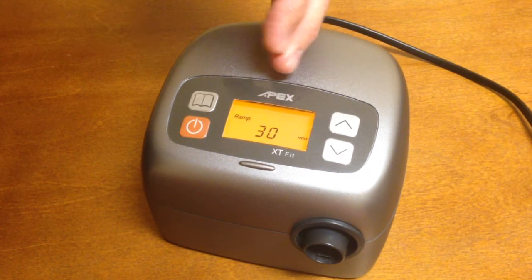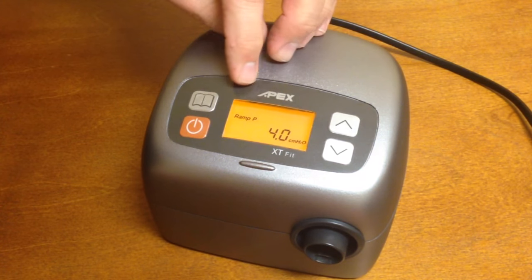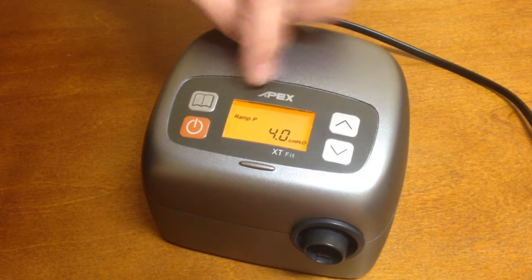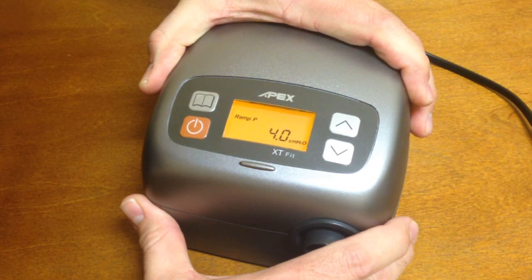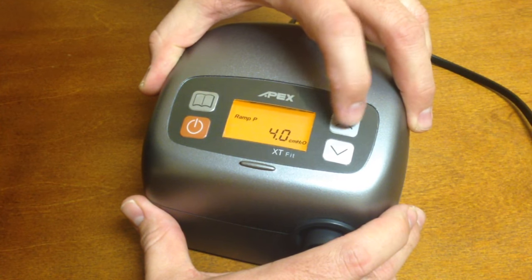To go to the next option, every time you want to go to the next screen, you just press the book button. Here we have our ramp start pressure — that's what Ramp P stands for. Press the up and down arrow at the same time and that will start flashing.